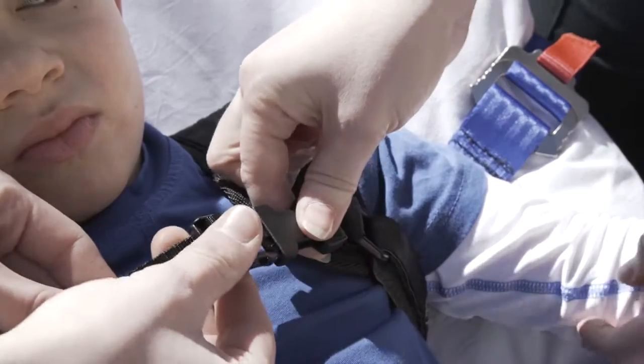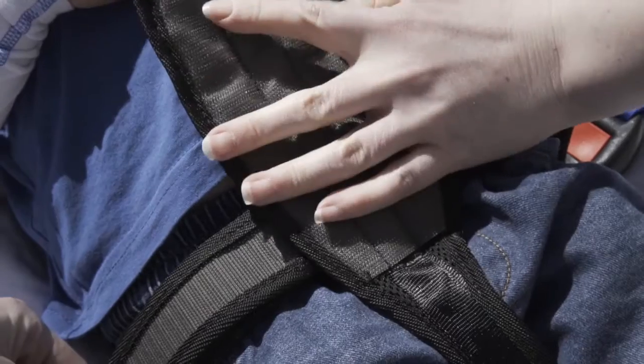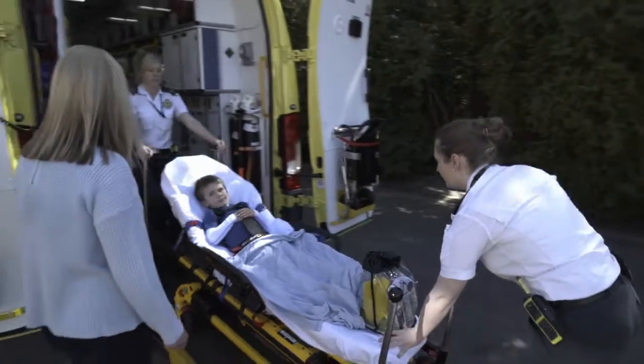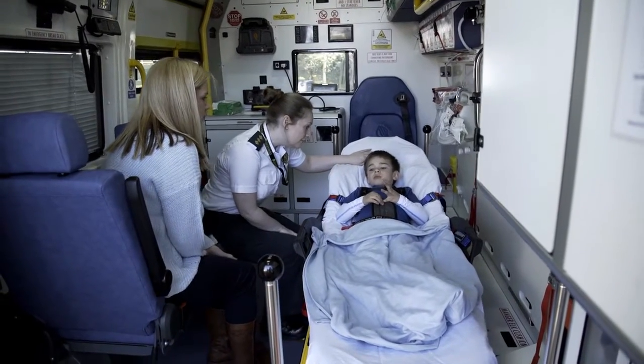The ACR doesn't create any pressure to the child's chest and clinically allows full access to the child without releasing them from the restraint. The ACR is one of the only ways to safely secure a child to a cot when transporting them.